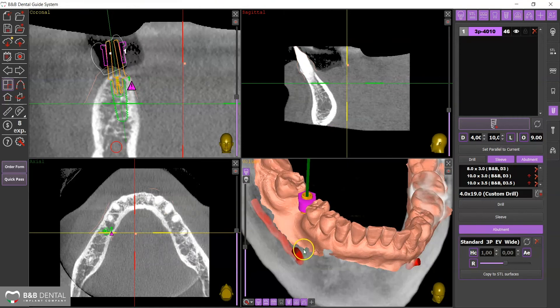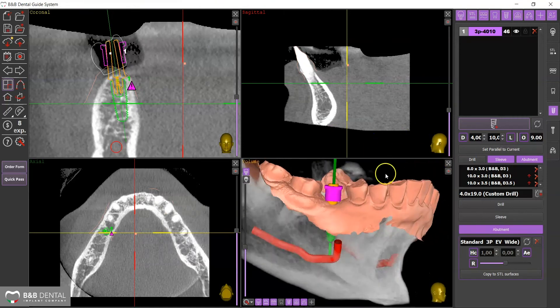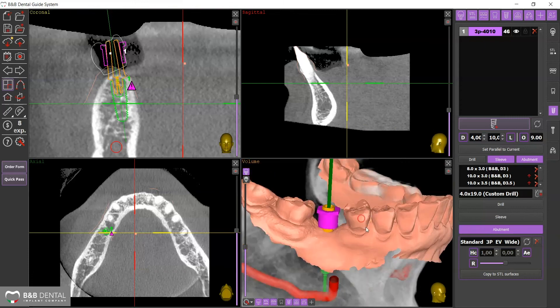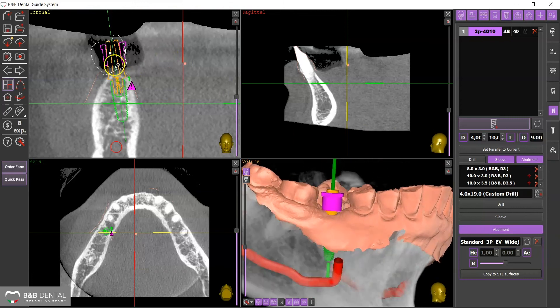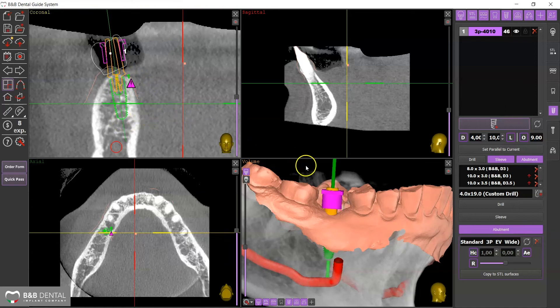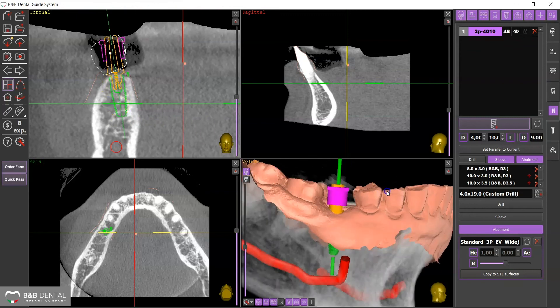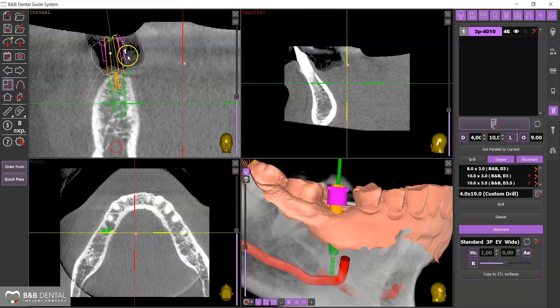It is important to remember that the sleeve hexagon corresponds to the direction of the internal hexagon of the implant, useful in cases with angled abutments. The sleeve anatomy collision warning signal will only be cancelled by moving the sleeve from its position — either by moving the implant higher or changing its offset. Given the resilience of the mucosa, you can continue without any problems if the collision on the mucosa is minimal.